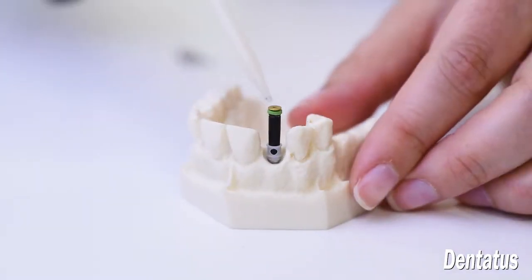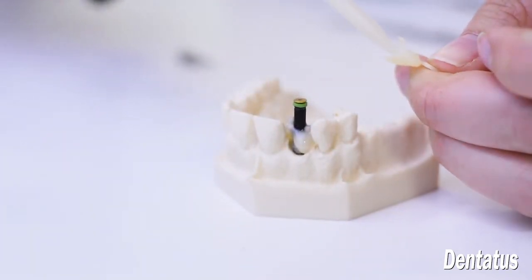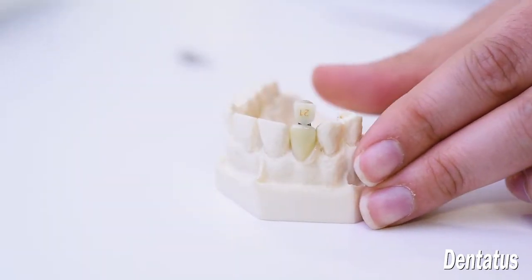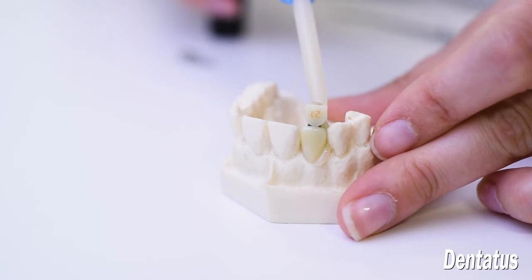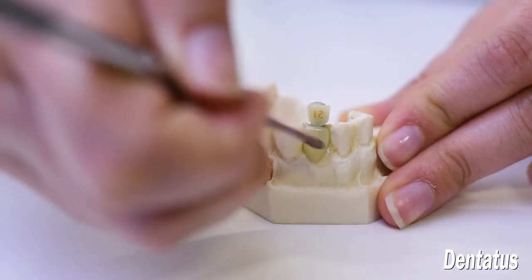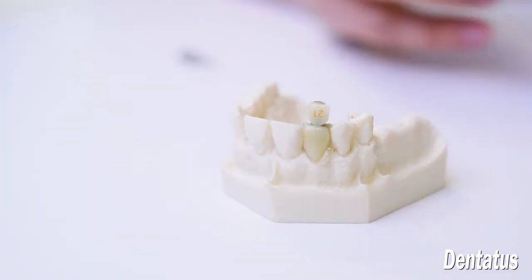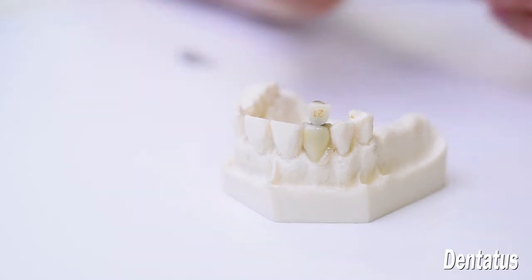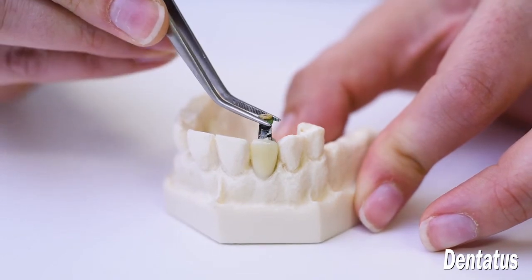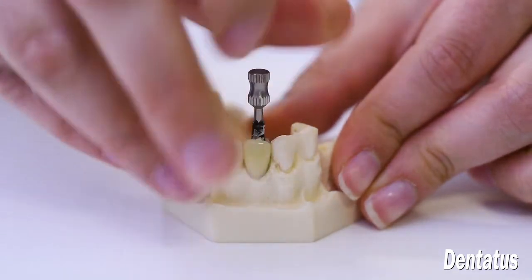AutoCure Composite is firmly adapted around the component and into the crown form. Then we clean out the interproximals to make sure that nothing gets locked on. Once the composite is set, the screw cap plug is removed and the screw cap is disassembled.